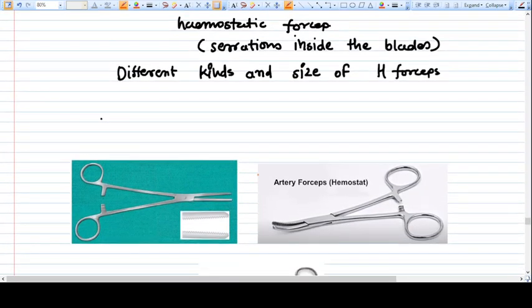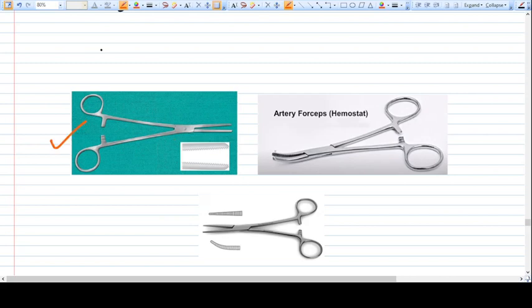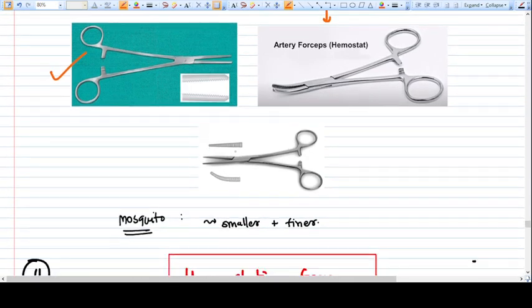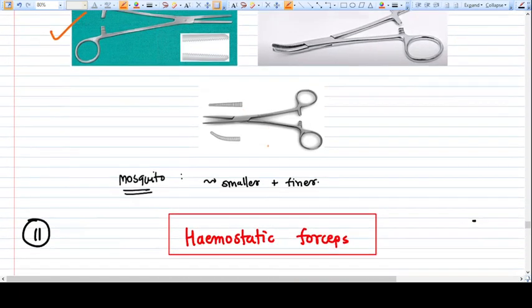There are different kinds and sizes of hemostatic forceps available. This is a long hemostatic forceps - some people call it a clamp - which is used in hysterectomy. This is medium size artery forceps in which the mechanism is the same. Here is a small mosquito forceps - they can be curved or straight, but the design remains the same.